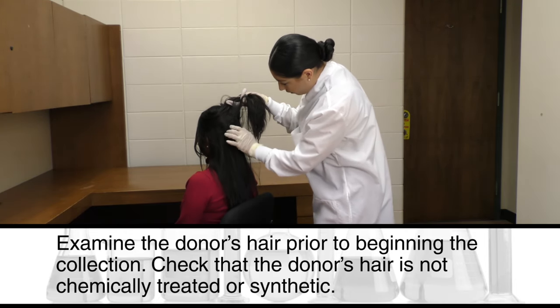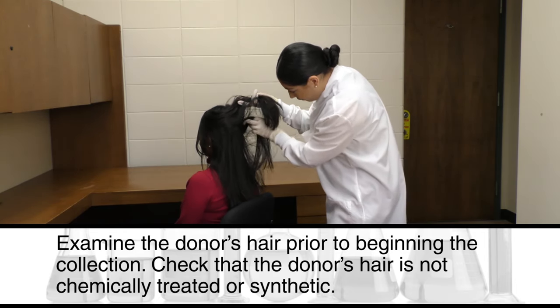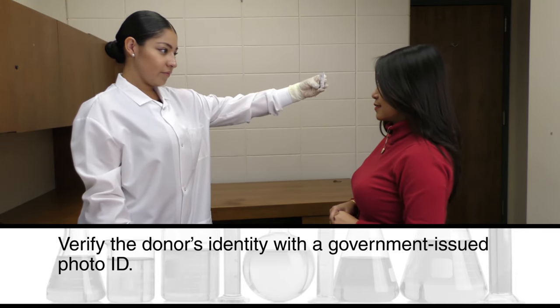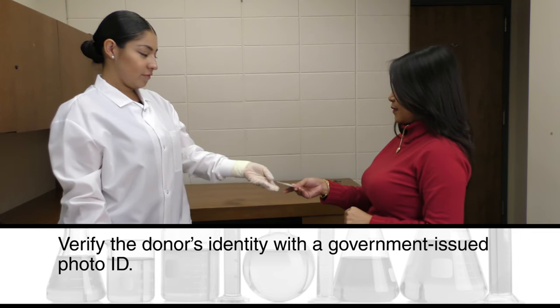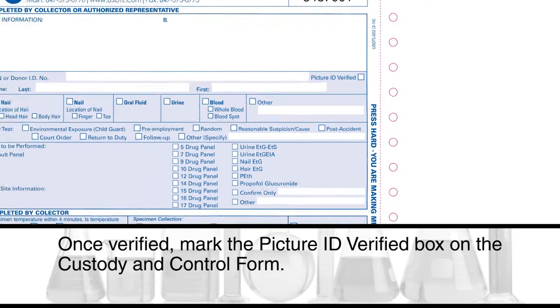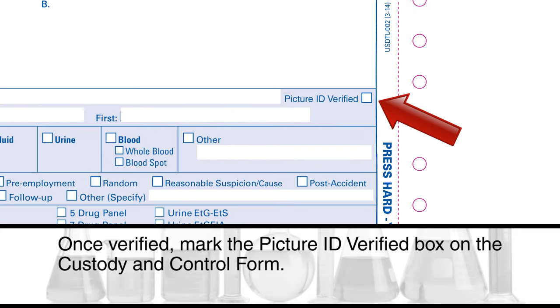Examine the donor's hair prior to beginning the collection. Check that the donor's hair is not chemically treated or synthetic. Verify the donor's identity with a government-issued photo ID. Once verified, mark the picture ID verified box on the custody and control form.